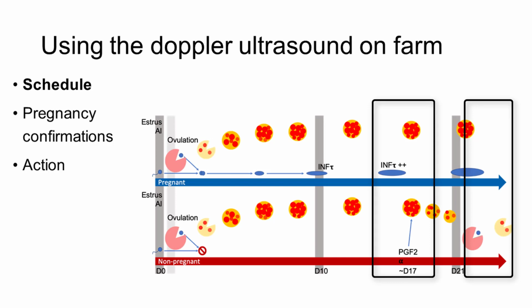If the diagnosis is made outside of the short follicular phase, you increase the number of cows falsely identified as potentially pregnant. This is, in itself, not as bad as falsely identifying non-pregnant cows, but you would lose the advantage you are seeking with the Doppler ultrasound to diagnose non-pregnancy earlier than with traditional methods.